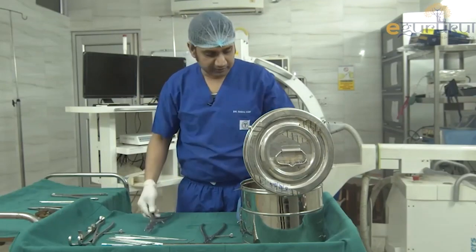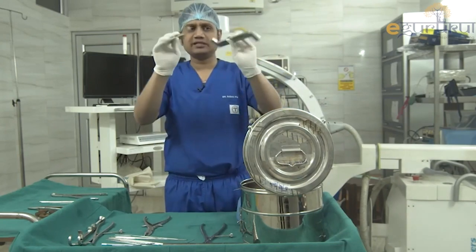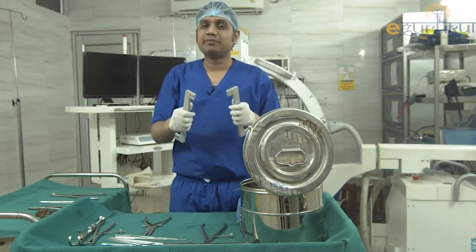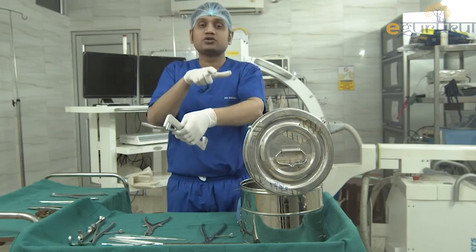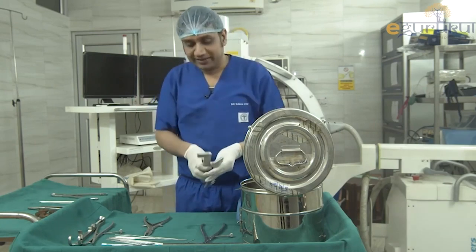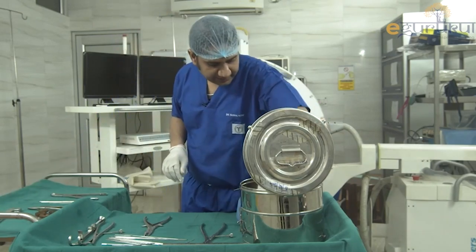Next are two key-like structures called plate benders. If a plate does not conform to the bone's contour — for example during both-bone forearm plating — you use these two instruments to bend the plate to match the contour of the bone.